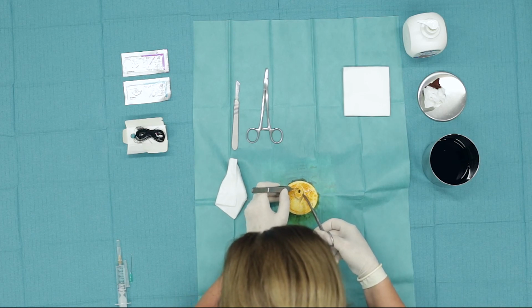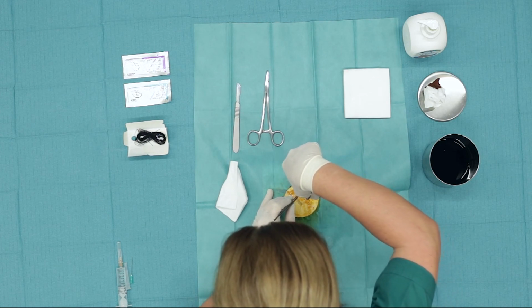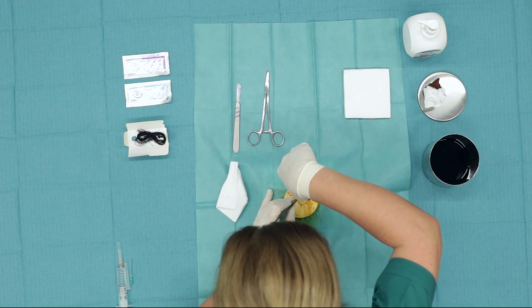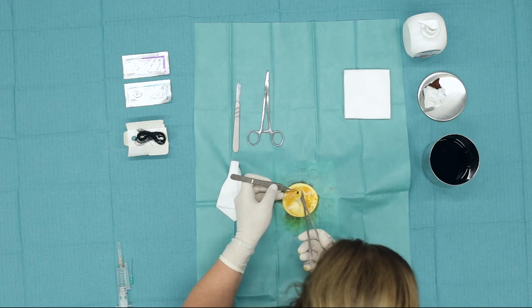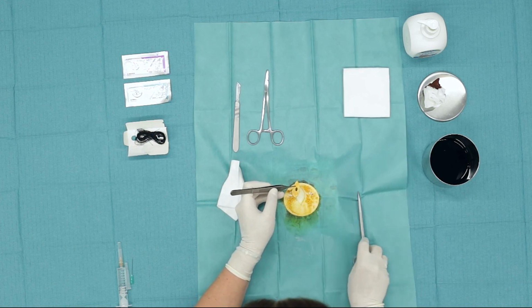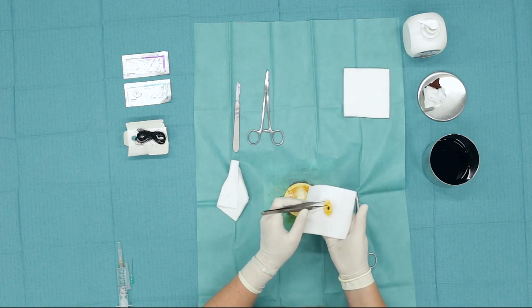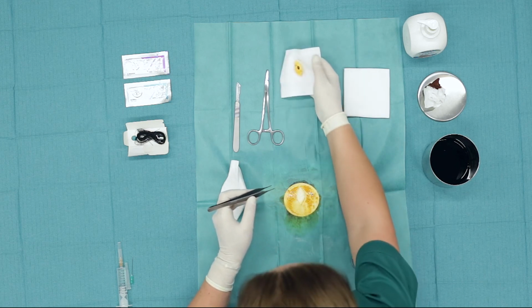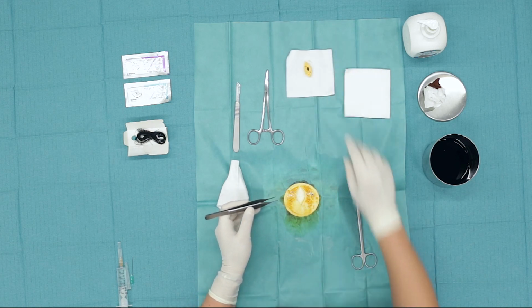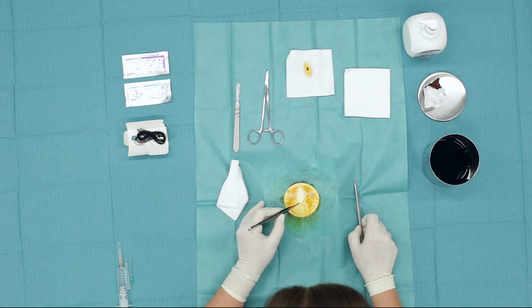In this way, without having much contact of the forceps with the formation that I remove, the removal of the formation is done, which after being completely excluded will be sent for histological examination. The created surface must be closed.